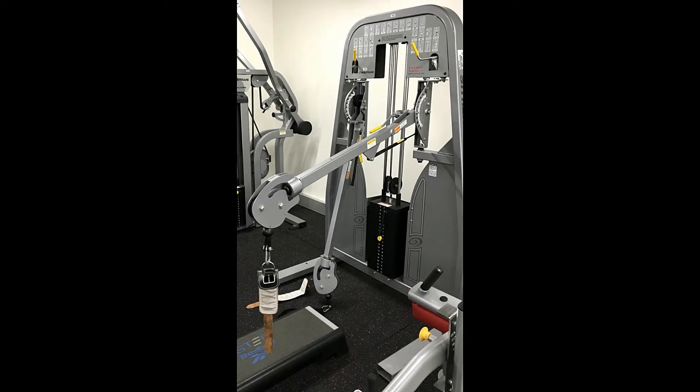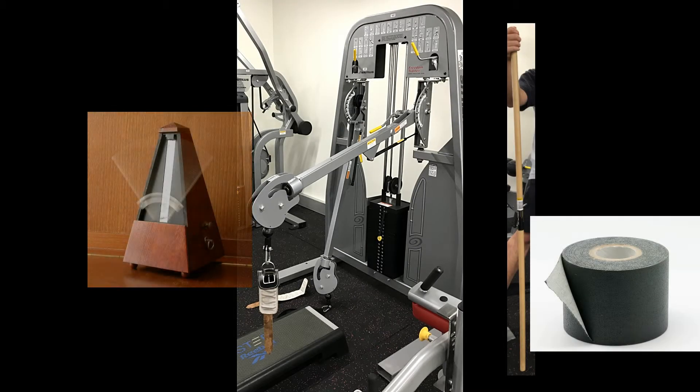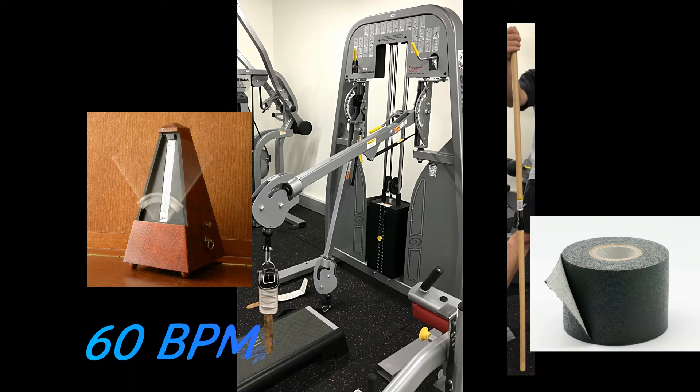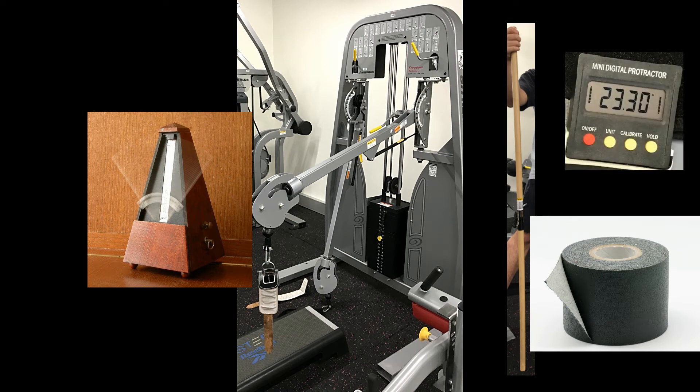For the test, we need a cable machine, stick, tape, metronome at 60 beats per minute — there are many apps which we can use — and an inclinometer.